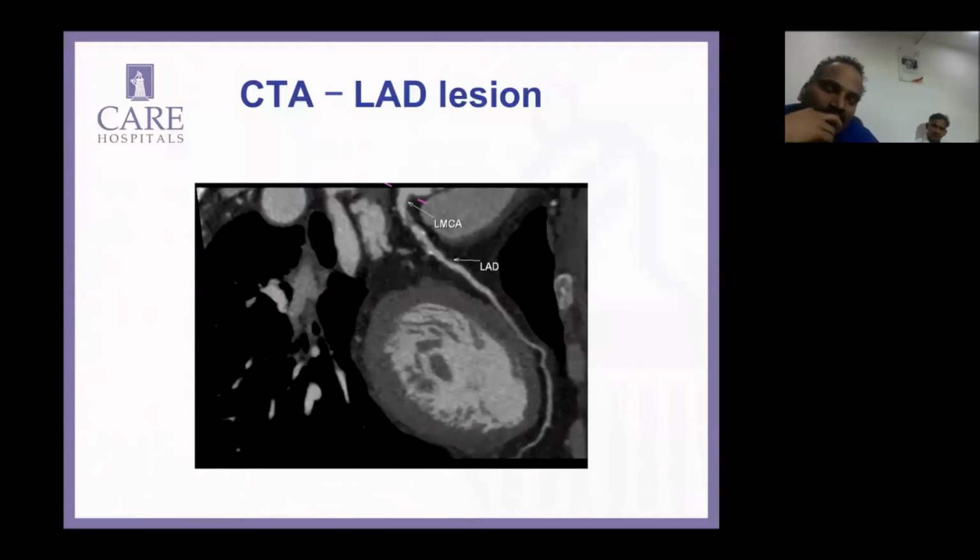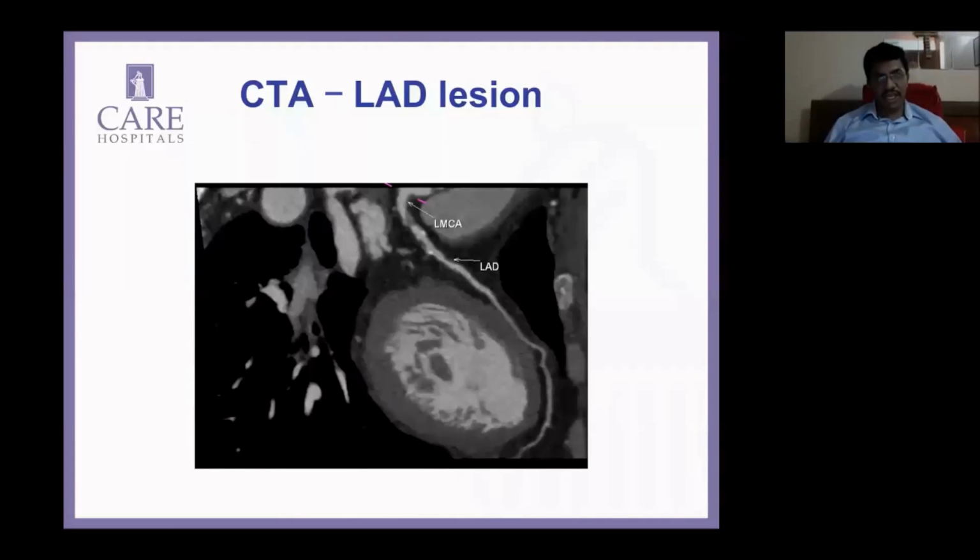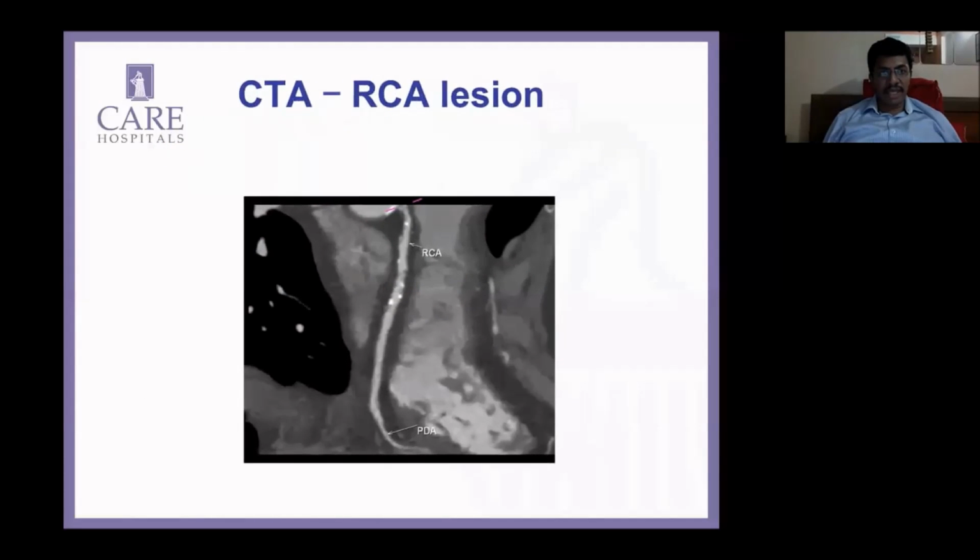Over to you, sir. Yeah, so just the role of CT, it is an established role. It has an appropriateness index of about 8 or 9 post bypass. I'm involved with one of my fellows where we are doing CT angios for all comers post bypass at 1 year. We are seeing about 95% patency on the LIMA, and we've done about 150 cases right now.